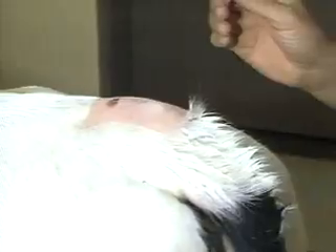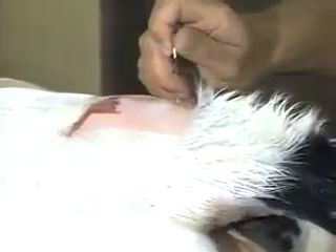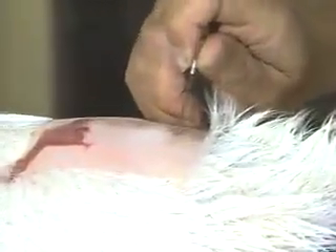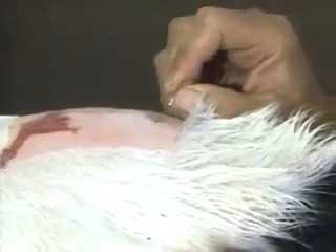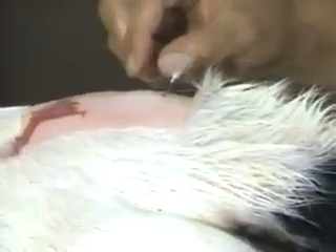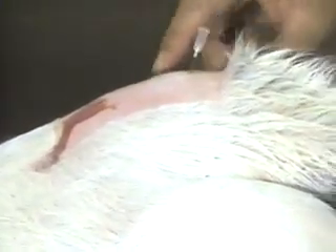The alternate site is at the next space — I'll just point out where that is. Right there is the site I entered. Here is the first coccygeal vertebra, and right there would be the second site, where the needle would be thrust in. So here's the first one, and there's the second one, to give an idea of how far apart they are.